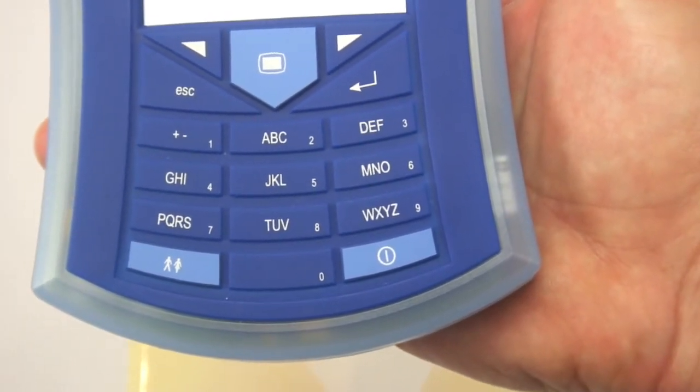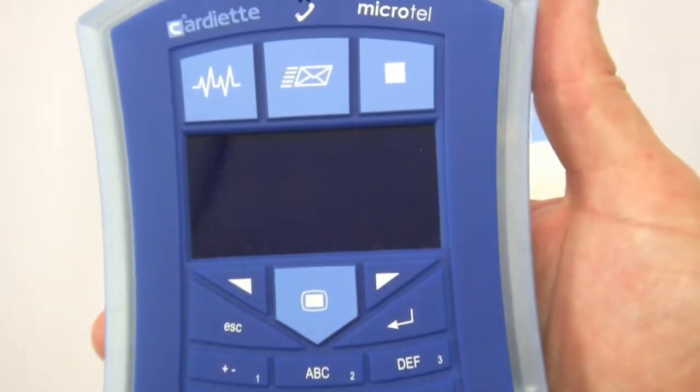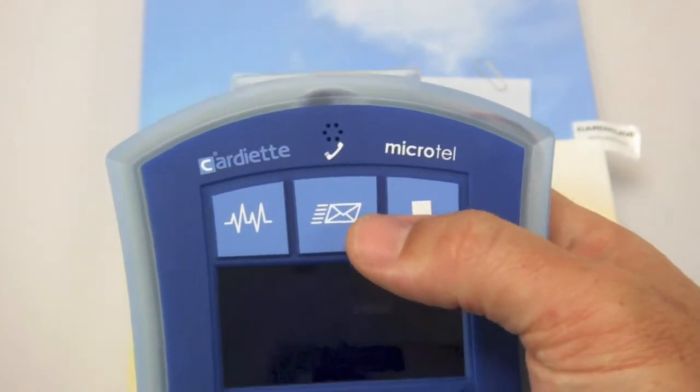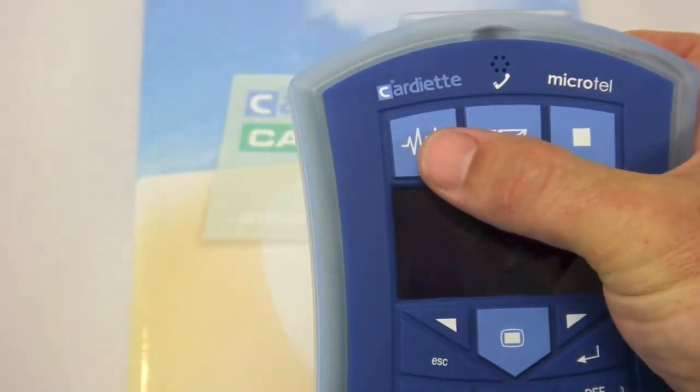If you choose to connect it away from the EKG, it has a single-lead preview screen that will show you waveforms before you capture data. It has a stop button, a send button to initiate a transfer to the computer, and a start button.